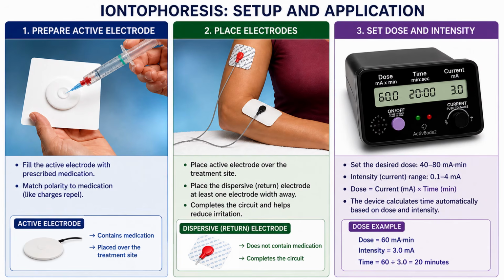Remember that dose equals current multiplied by time. Modern units automatically calculate the treatment time once the desired dose and current are entered. This allows you to safely deliver the prescribed medication while minimizing the risk of skin irritation.